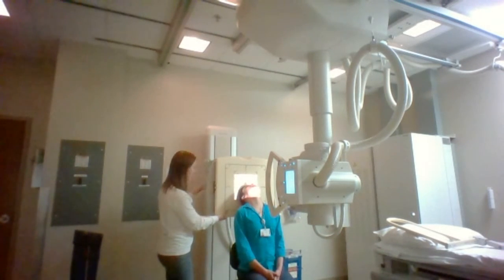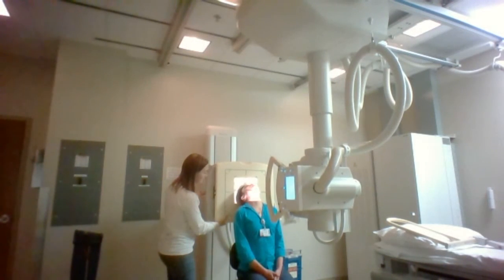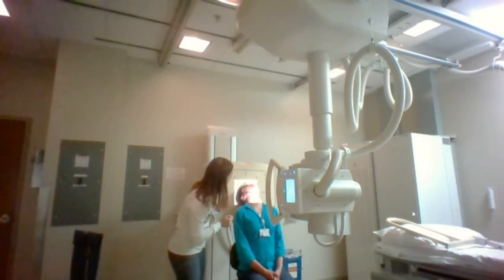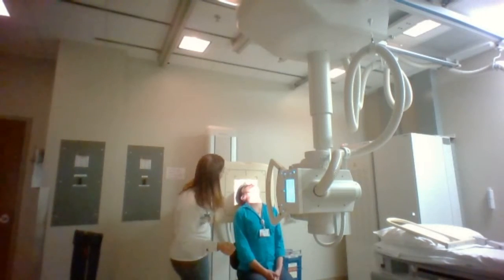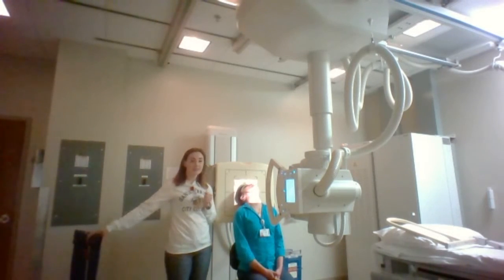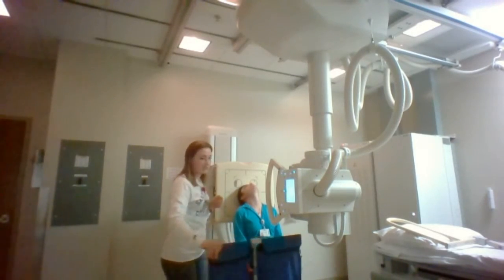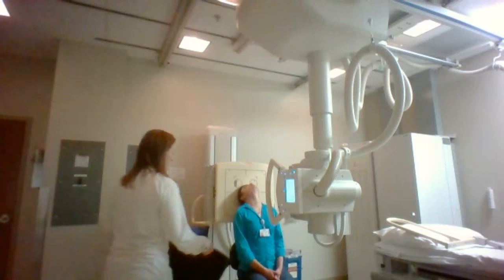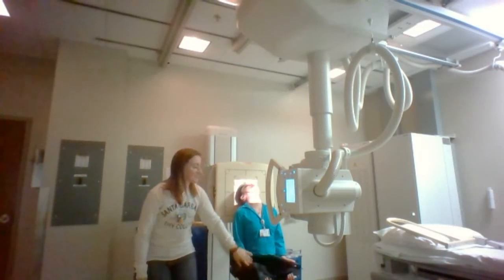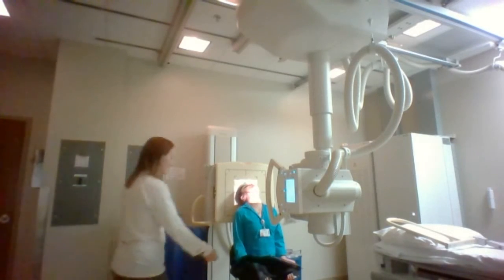Sky's board is going to move a little bit here, okay? We're going to come on down in between the angles of her mandible here. And collimation I'm pretty happy with. We're going to leave it like that. For this one, we're going to use the technique of about 85 at 14 mAs. I'm going to put on another shield. Hold your breath. Expose. Okay, you can relax, guys.